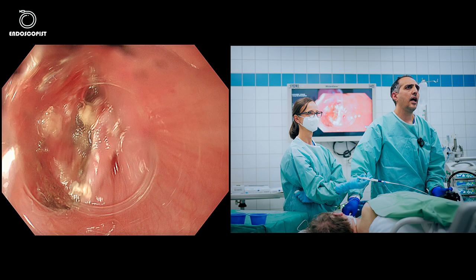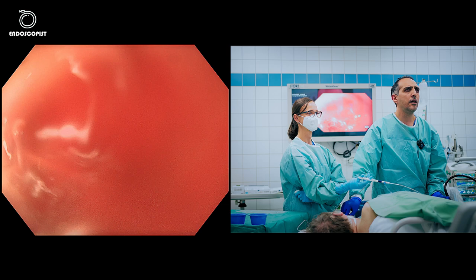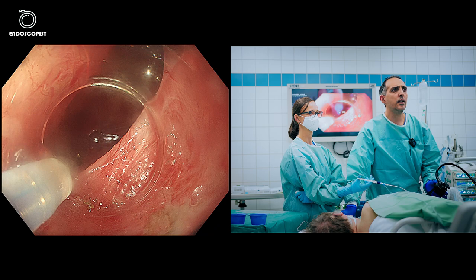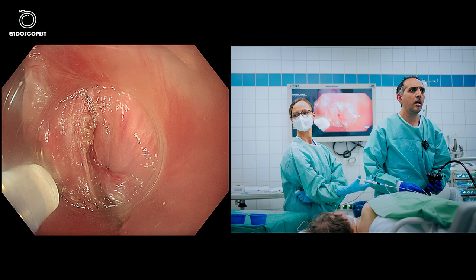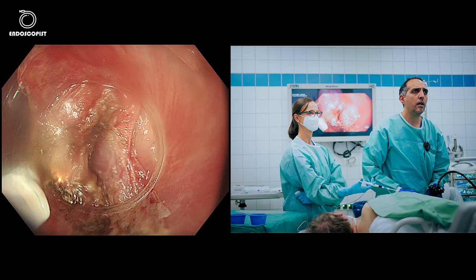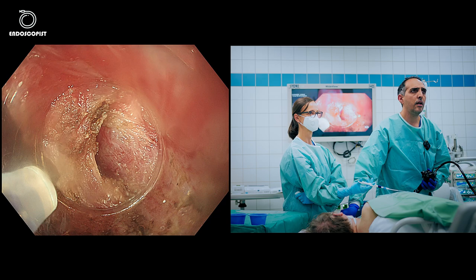You can see here the septum and the cricopharyngeal muscle. I'll push the knife to dissect this bridge, hooking on the muscle fibers and cutting. You can use spray coagulation or Endocut Q — it's your preference. I have to make sure the mucosa stays intact on both sides. You can see the thick cricopharyngeal muscle which is causing this patient's problems.